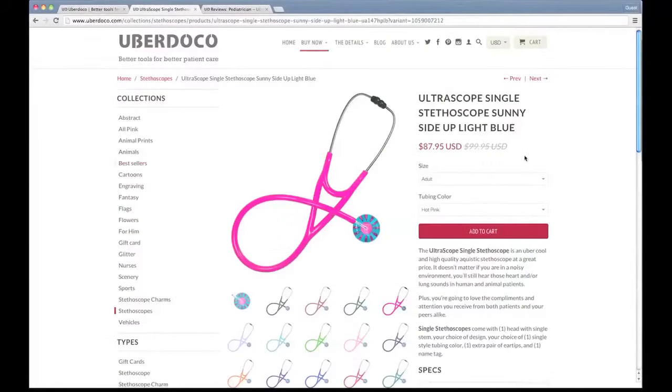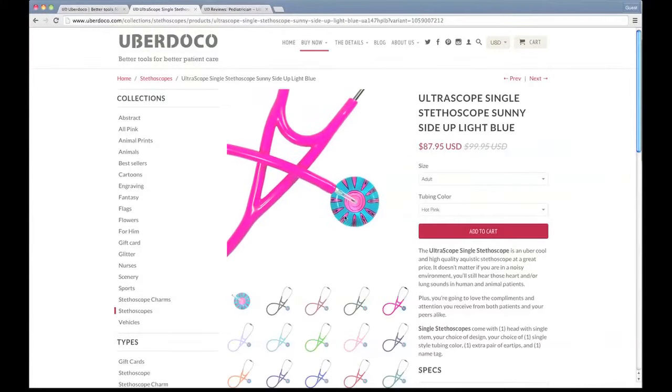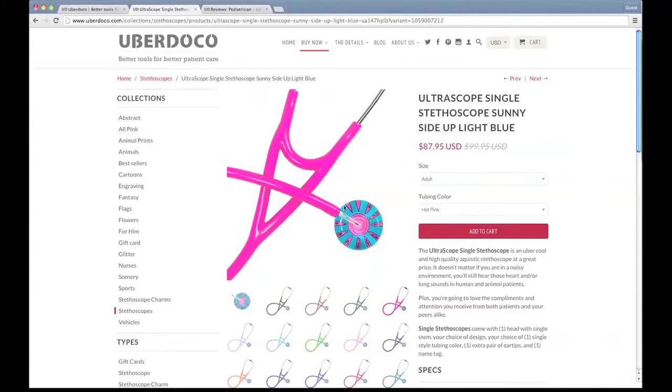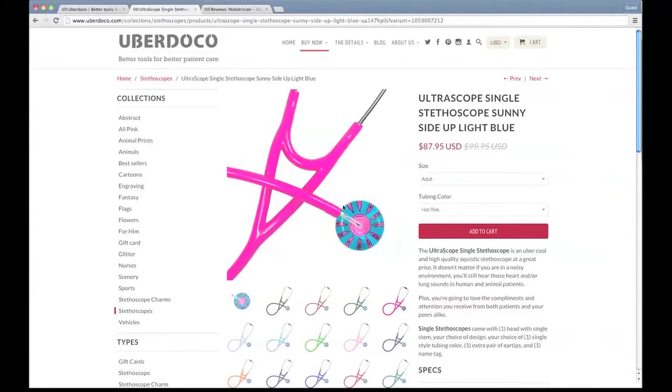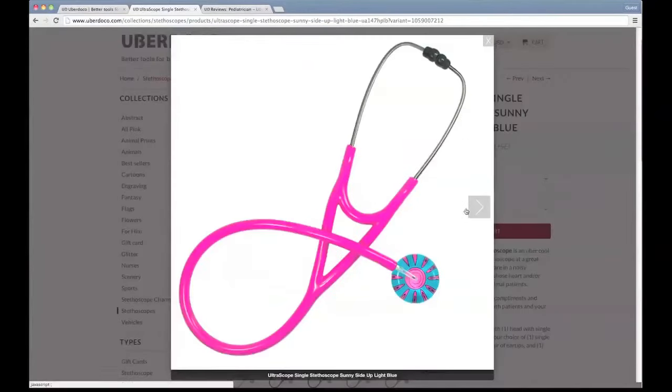Let's have a look at what one of these designs looks like. Over here we have the Ultrascope stethoscope Sunny Side Up light blue. This particular stethoscope comes in a really nice hot pink tubing — beautiful, very vibrant, very attractive. This design also comes in various different tubing colors such as lavender, light blue, green, light pink, dark blue, and various others, so you have a lot of choices and can customize to whatever color combination you love.